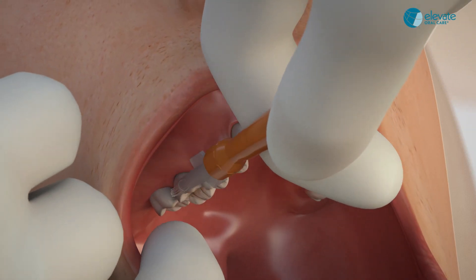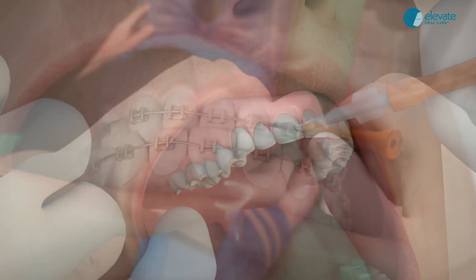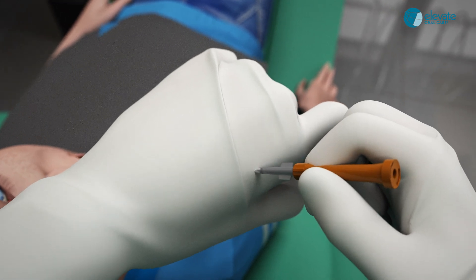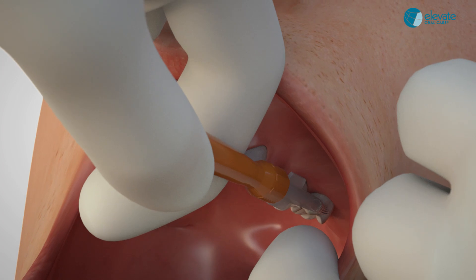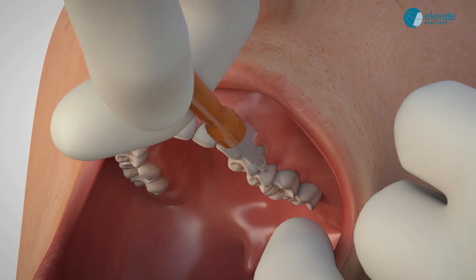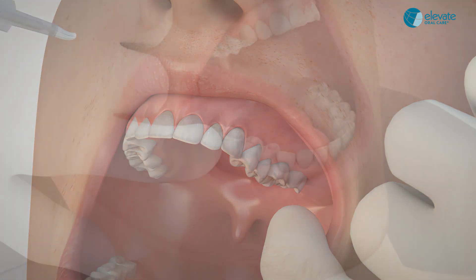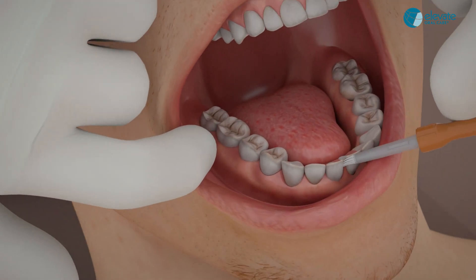For adult patients, paint one swipe on the facial surface of each quadrant from posterior to anterior. As needed, re-wet the brush on a piece of gauze or the back of your glove. Paint the other quadrants using one quick swipe from posterior to anterior to prevent over-application and create the thinnest coating for your patients.